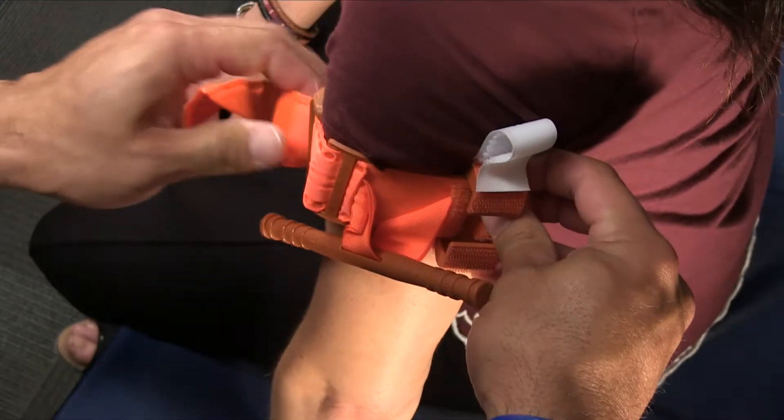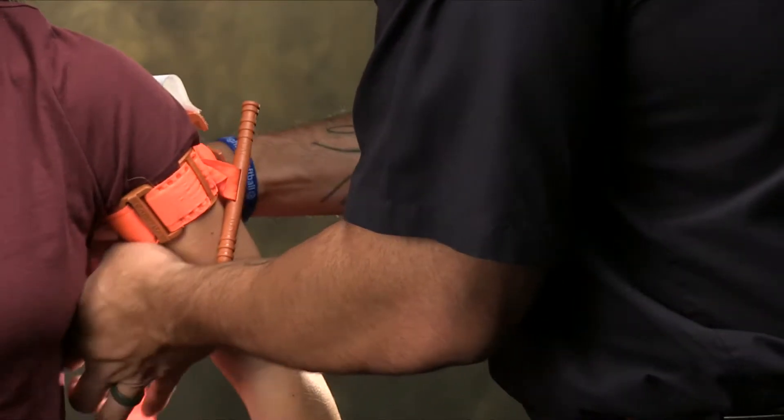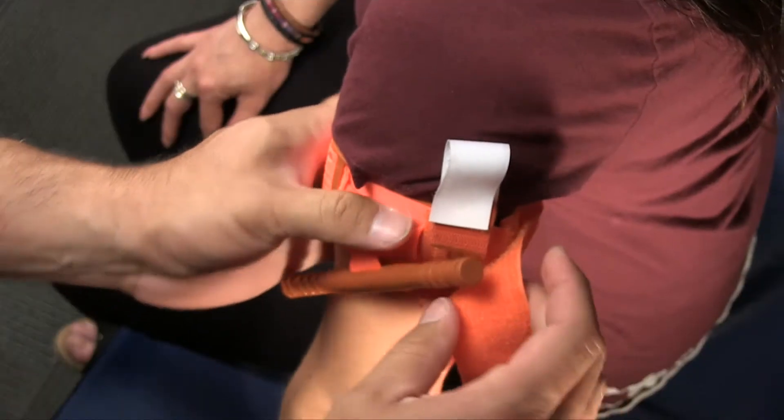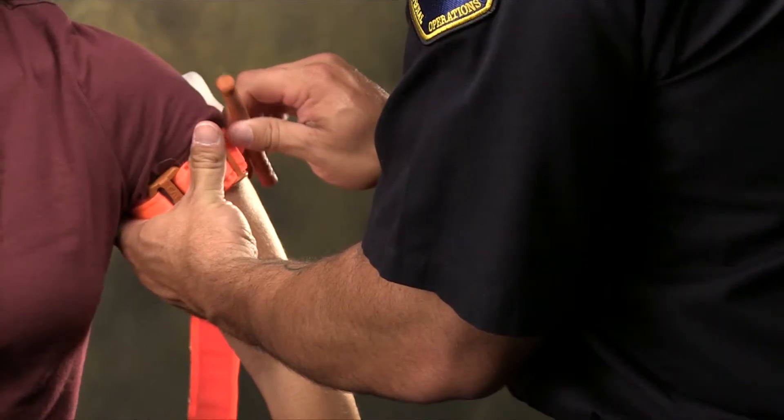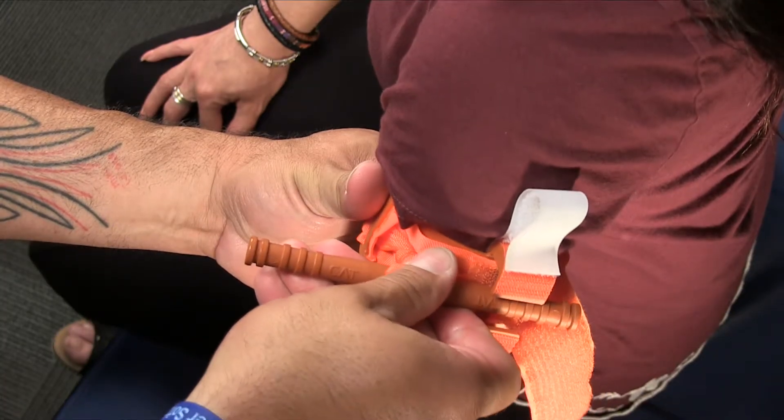Hold the tourniquet in place and pull the end of the band as tightly as possible. Secure the self-adhering band from the buckle to the windlass clip but not through it. Turn the windlass or rod to apply pressure until the bleeding stops — this often requires two or three turns.